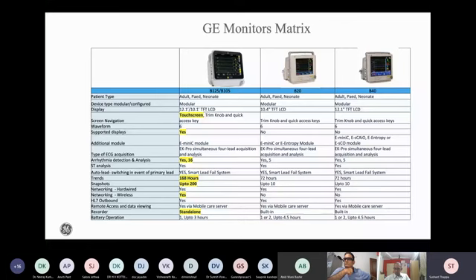I haven't been in touch for some time, but what I remember is we used to have the PDM module which had a battery inbuilt, and all of this data that I just told you about, right from waveforms in ECG, SpO2 numbers, EtCO2 waveforms and numbers, all of this can be sent to not just a central server, but also to a mobile server, which means the digitization enables the doctor or the caregiver to see all of this data on a mobile phone.